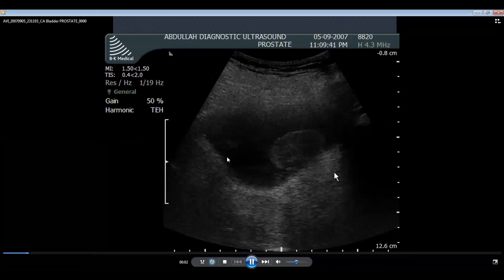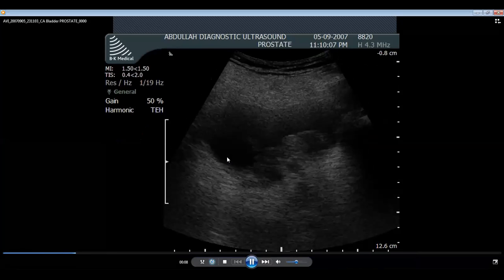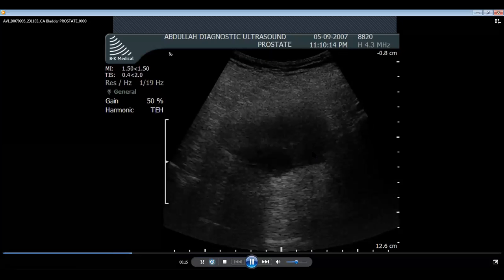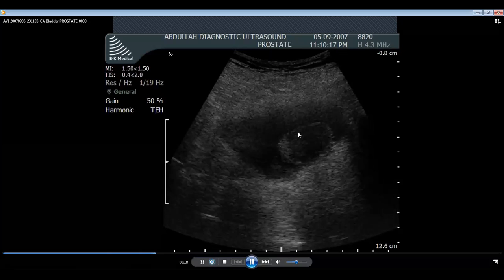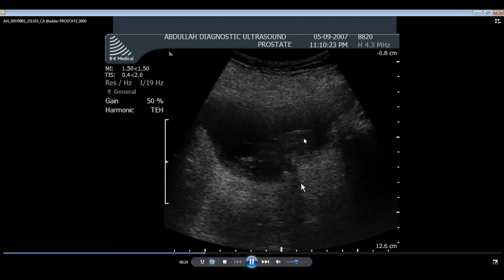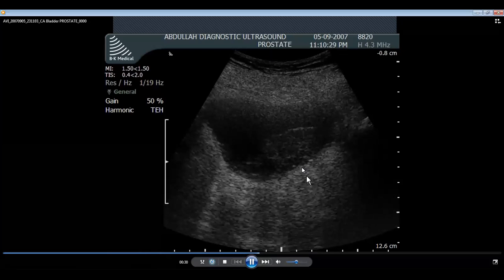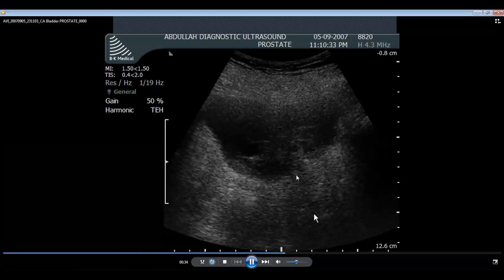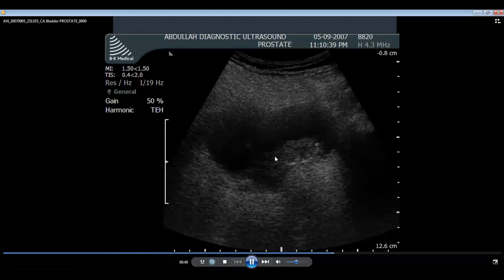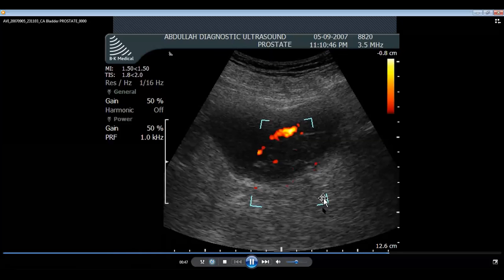So, whenever we come across a patient who has got painless hematuria and we are suspecting some growth in the bladder, that growth will appear as a polypoidal lesion projecting itself into the bladder, as you can see here, from the posterior and left lateral wall. This growth is projecting into the bladder, and it is in fact covering the left ureter as well, and it was producing mild left hydronephrosis and hydroureter. When we put color on it, invariably it will appear very, very vascular. So we will show you in a moment how this growth will appear.